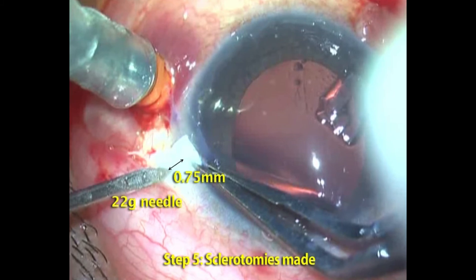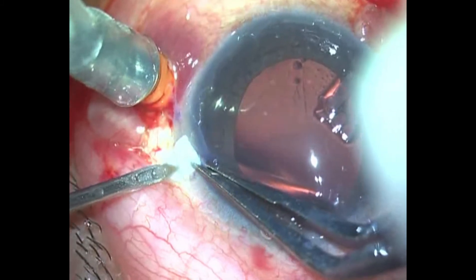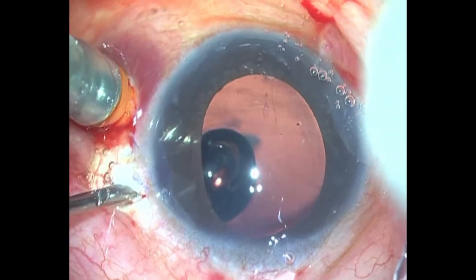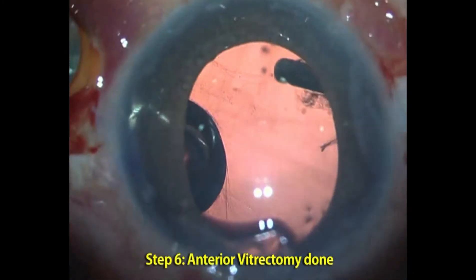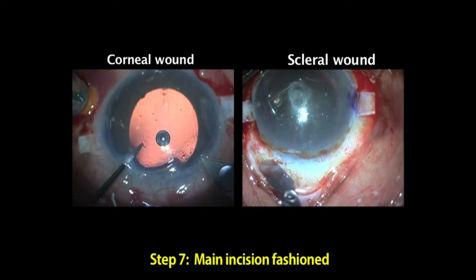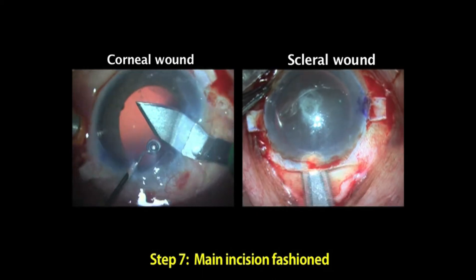0.75 millimeters behind the limbus, 22 gauge sclerotomies are created. This is not only for performing anterior vitrectomy but also for removing any residual lens matter left behind. An incision is then fashioned.